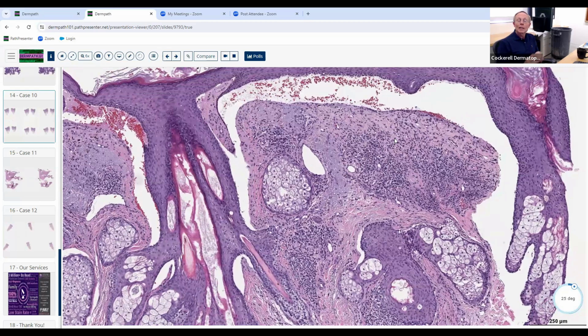You can also see lymphs and eos in epidermolysis bullosa acquisita. There's several different patterns of EBA. There's one that's got basically no inflammation. There's one that's got neutrophils. There's one that's got lymphs and eos. There's one that really looks kind of like epidermolysis bullosa in the mechanobullous form.